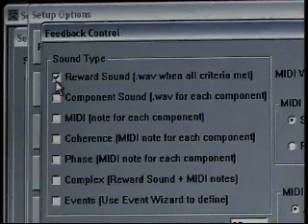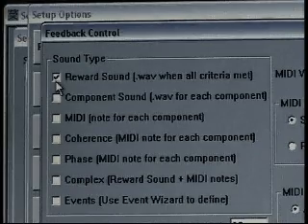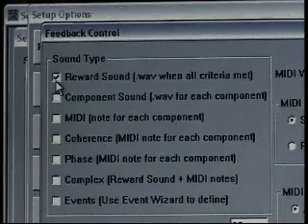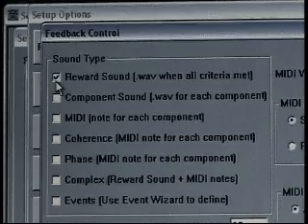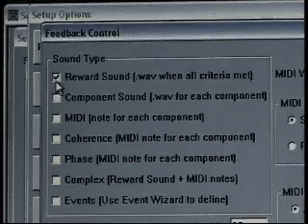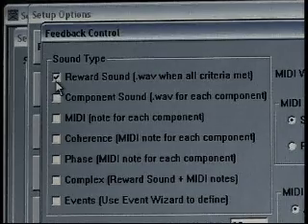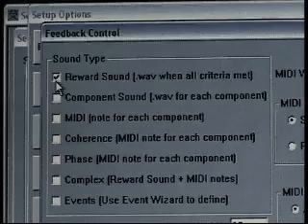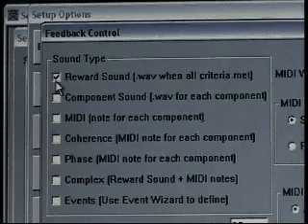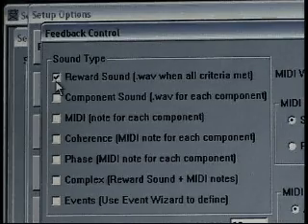Knowing that we're down-training theta, up-training beta, and down-training high beta with this particular protocol, when all three of those components are within criteria or meet range, we're going to hear a bell, for instance.